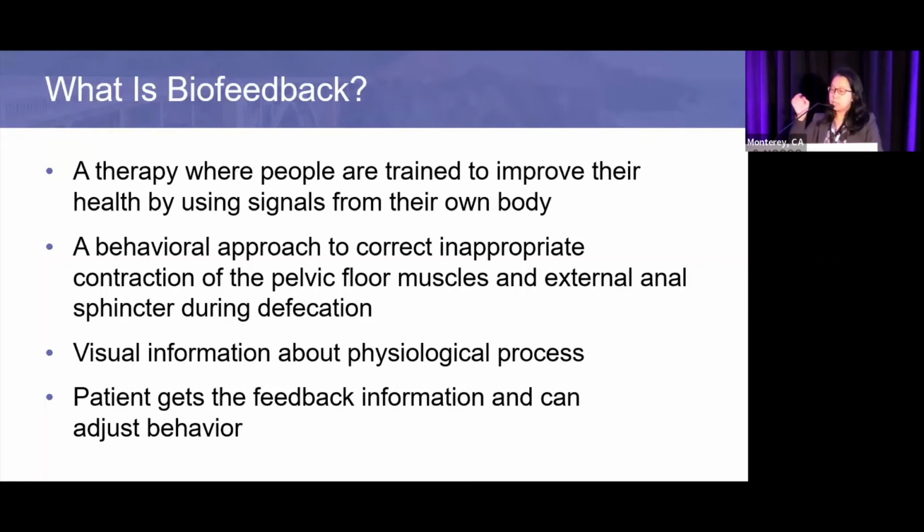You get that visual information input about the physiological process, and the patient gets feedback and then can adjust behavior. So this is not used just in fecal incontinence or constipation. It's used actually in anxiety, depression, people after stroke. So when you assign patients to biofeedback, make sure you be specific. I had a patient who had experienced biofeedback, and I said, "Oh, you're gonna need biofeedback therapy," and the patient said, "No, I have no depression right now. I'm fine now." I said, "No, this is biofeedback for your anal sphincter, not for these other purposes." So again, specificity. We do this so often, sometimes we forget to tell patients that.